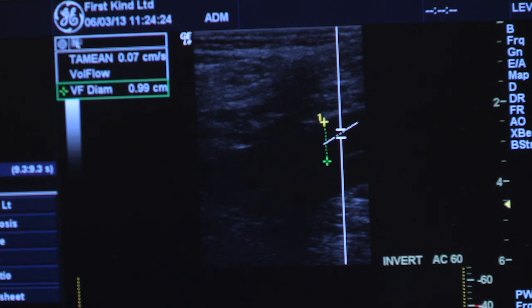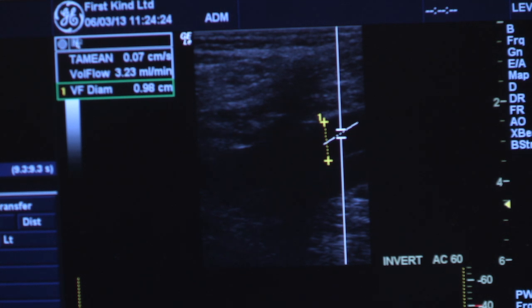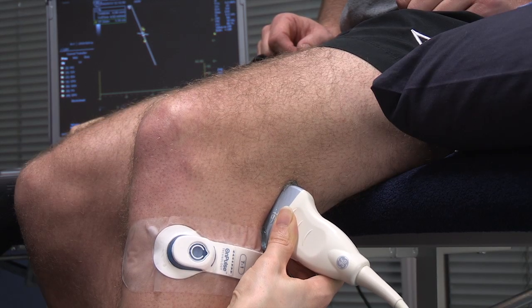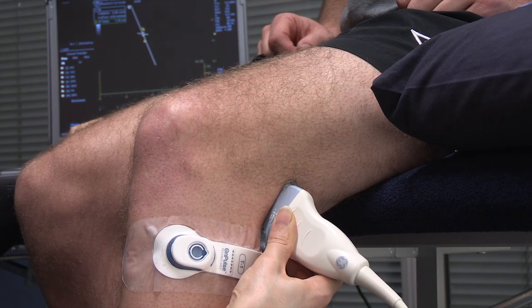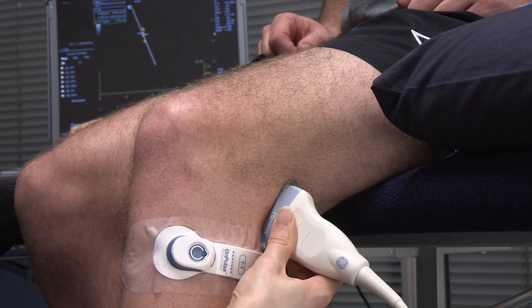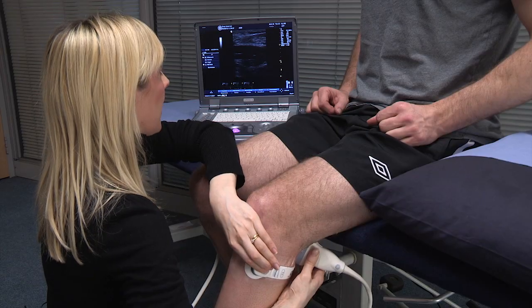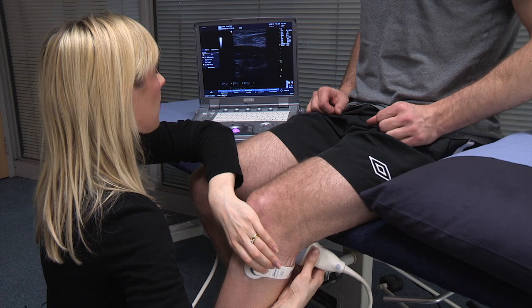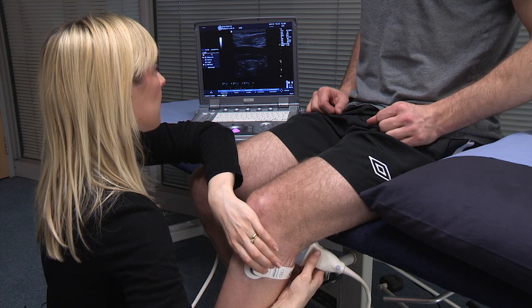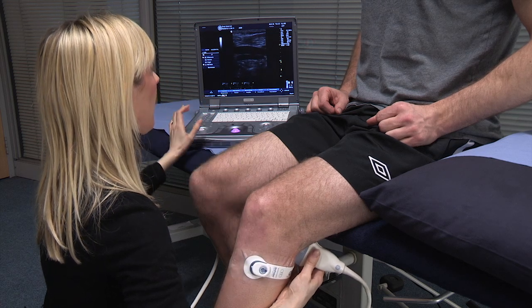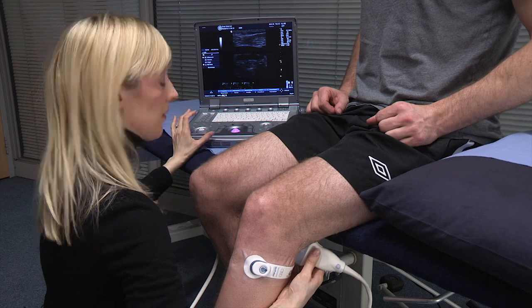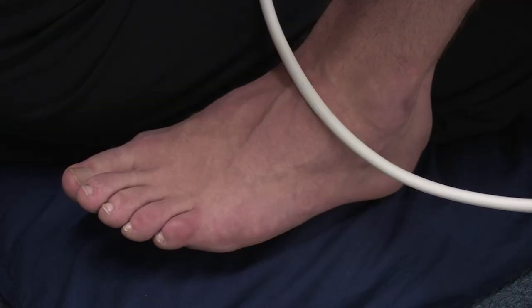We've got a volume of 3.23 mils per minute. Now we're going to take another measurement, but this time we're going to put the gecko on. I'm going to put the gecko on level three.